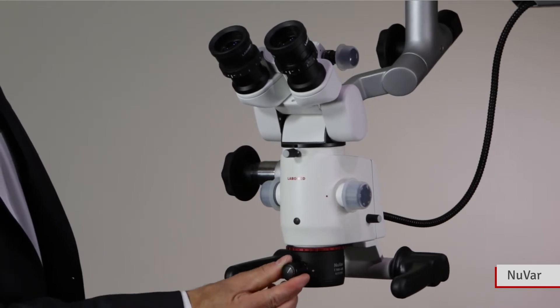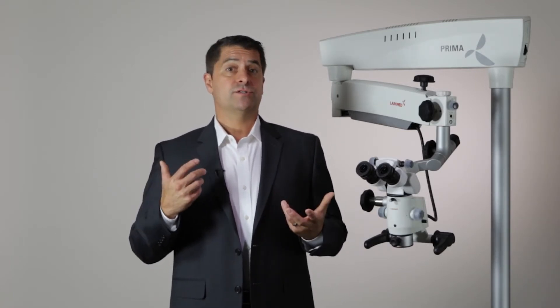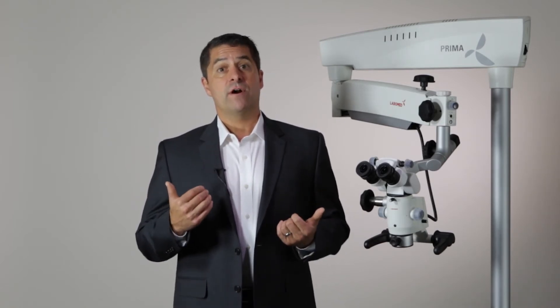The NuVar is a variable working distance objective with focal length of 300 to 400 millimeters. Working distance is the distance between the microscope and the subject. Having a variable focal length means less repositioning of the microscope when focusing on different regions of interest or when a patient moves. A variable objective is also useful in multi-user environments with different working distance preferences, helping new microscope users get over the learning curve quickly.